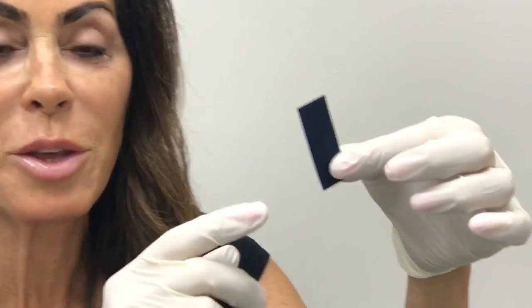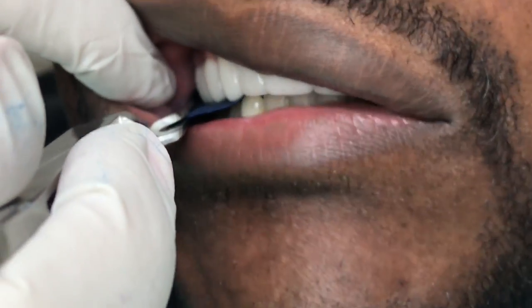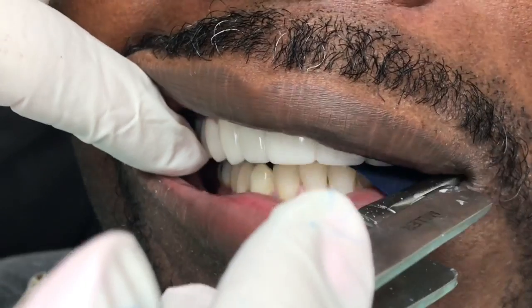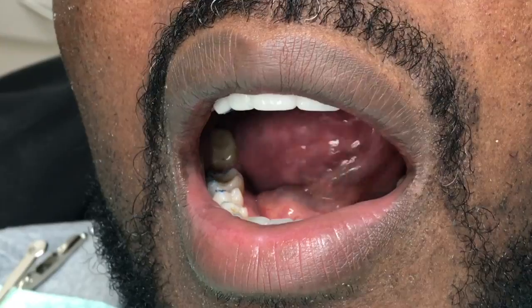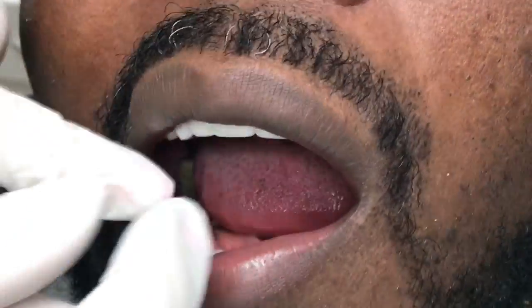Okay, this is articulating paper. This is what you need to check the patient's bite before they leave your office. I don't know how these online companies expect you to have a perfect bite when no one sees a dentist and nothing is adjusted. So let me show you how this works. This is articulating paper, and we're going to go ahead and place it in his mouth. We're going to have the patient bite down on both sides. Tap, tap, open, and tap, tap. Again, and open. And we asked the patient, where are you hitting first? When we had asked him previously, you were hitting on both sides in the middle first, right? Correct. Okay. So I'm going to take it out, and I'm going to show you what I'm talking about.